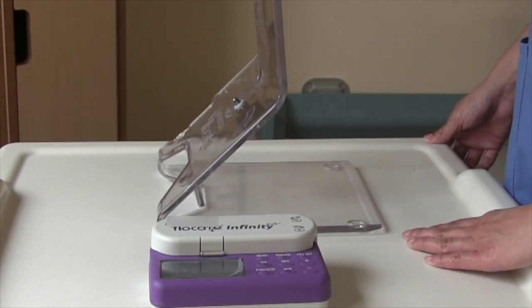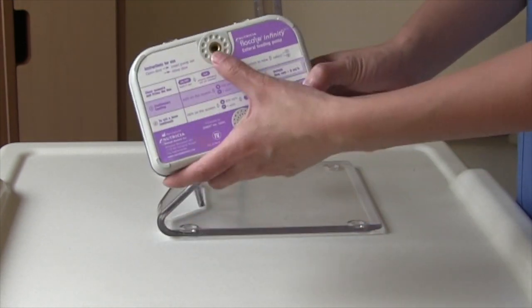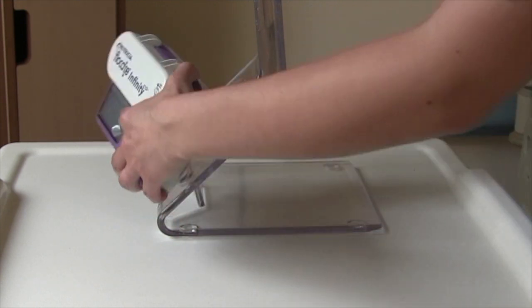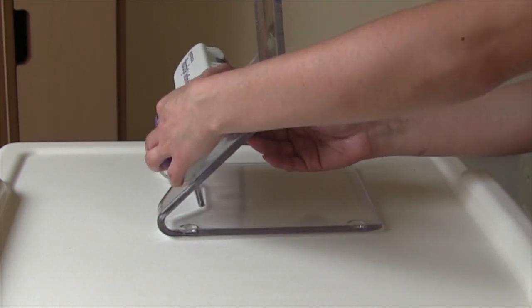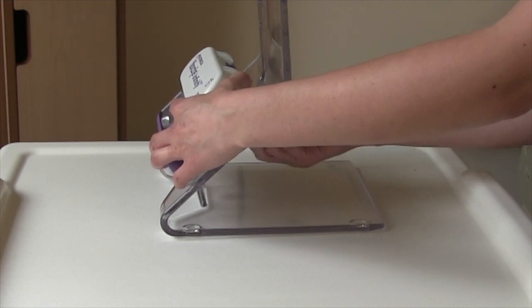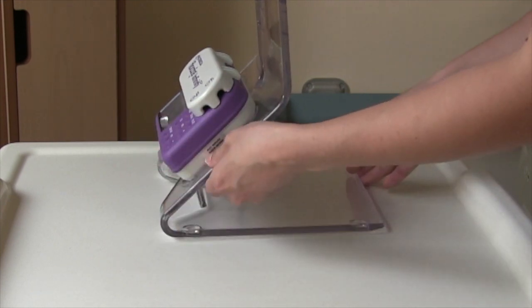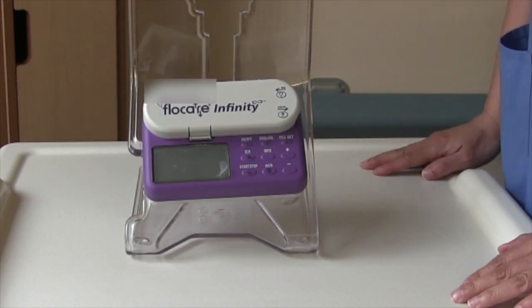To set up the pump on your stand, simply find the screw connector on the back and place it over top of this screw and simply screw the pump on. Just tight enough so that it doesn't move, and that's how you set up your pump.